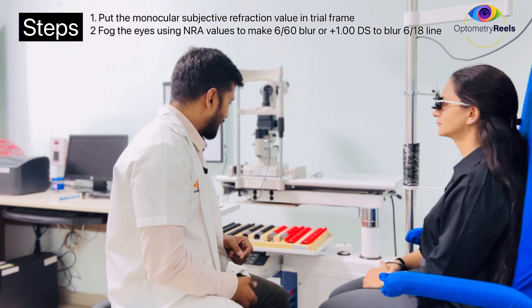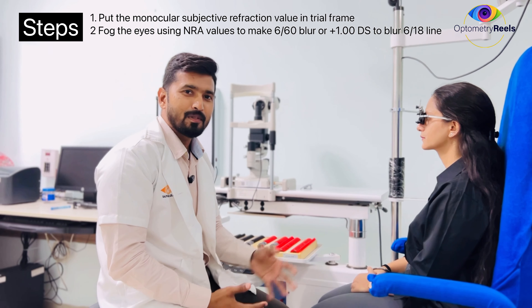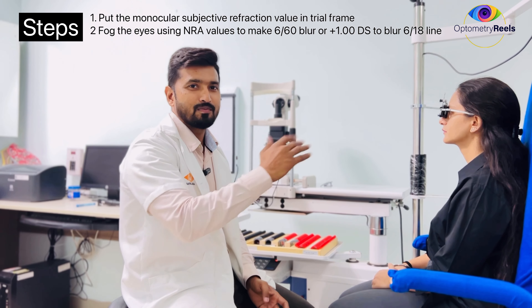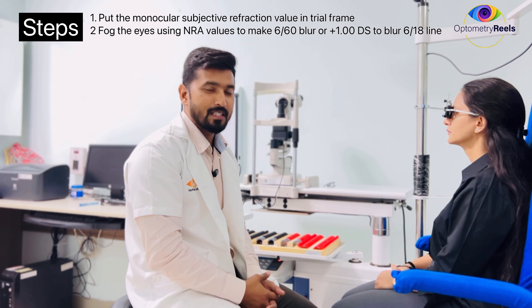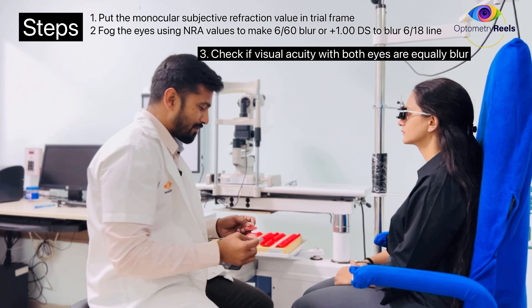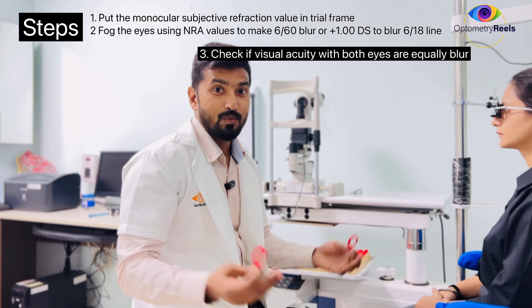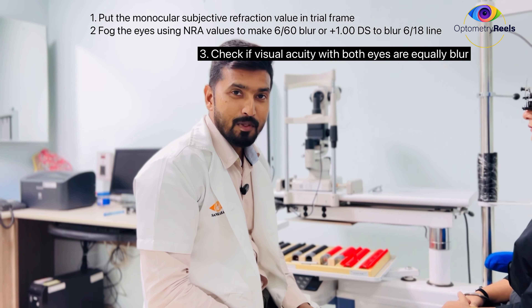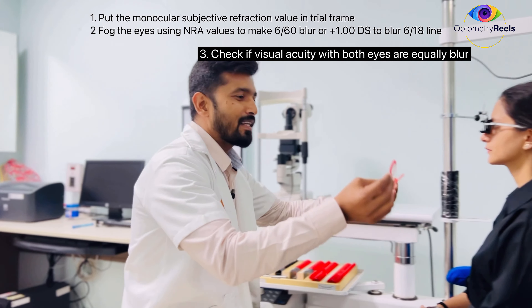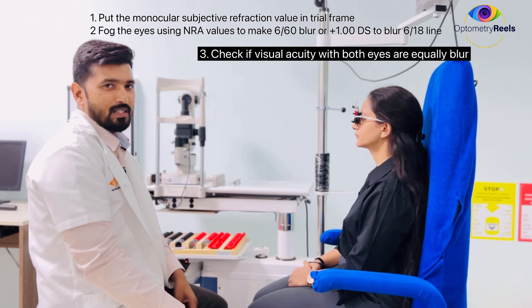To start binocular balancing, we need to fog the eye. There are various ways to fog — some people use a partial method by putting +1 to fog two lines above the best corrected visual acuity. But here I have used the NRA method and got +2.5 as the fogging lens. If you want to learn more about NRA, the video is already uploaded — you can check the description. So my NRA value for the patient is +2.5, and I am going to put it in front of her eyes.